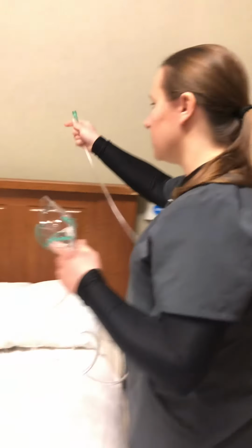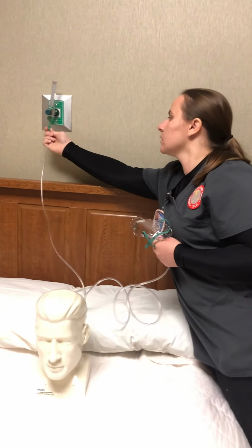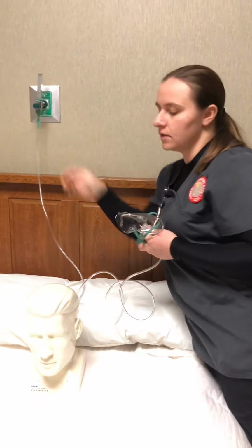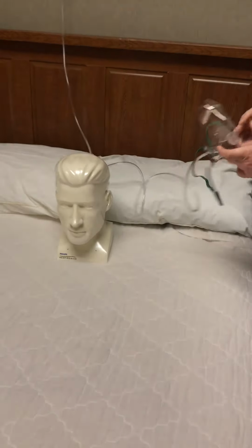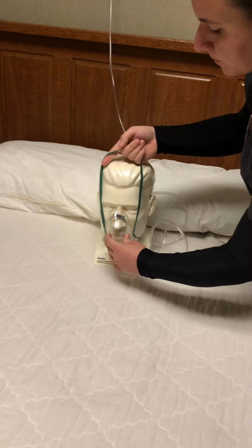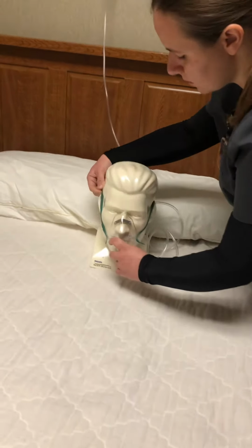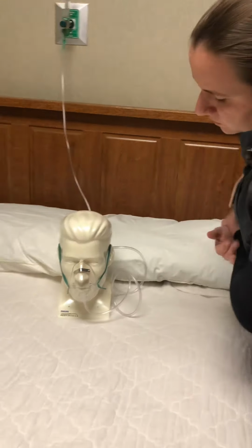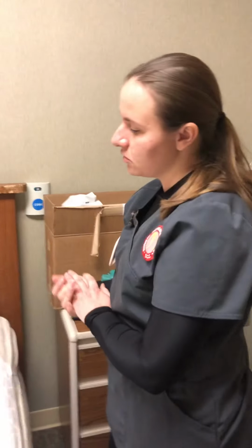So I'm going to set this up for you at 5 liters per minute. I ask that you leave this on. If you have any difficulties or anything, please let us know. So I'm going to place this over your face, okay? And then I pinch the nose piece here. I ask that you leave that on, and I will come back and check on you.